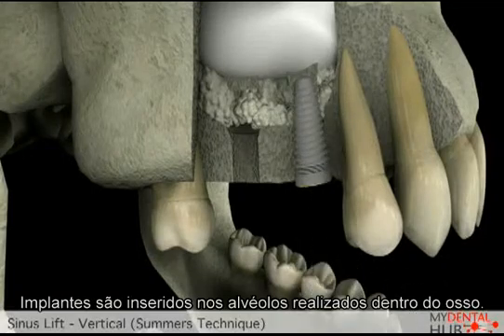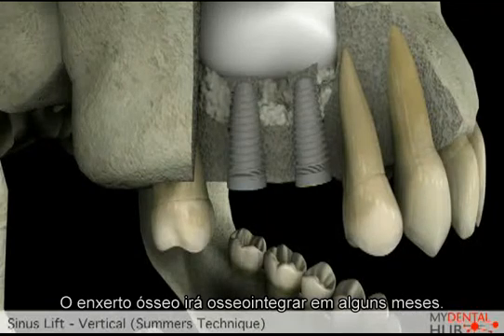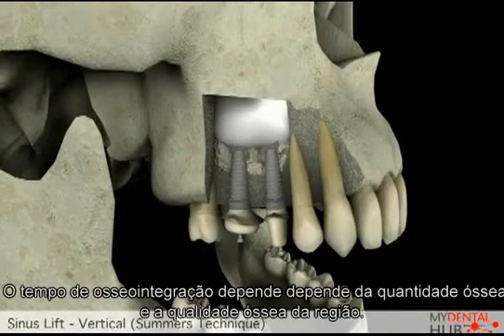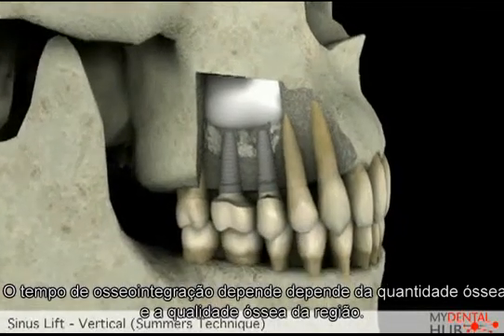Implants are then placed into the prepared sites within the bone. The bone grafting material will consolidate into bone after several months of healing. The healing time will depend on the amount of sinus lift that was required along with the amount of bone grafting material used.